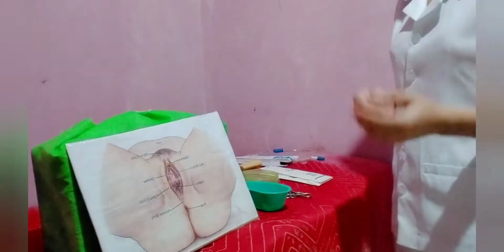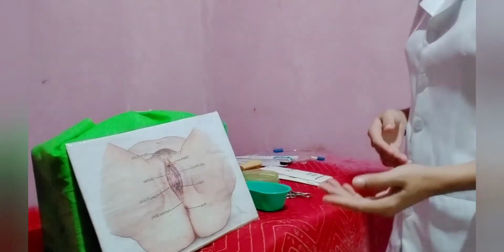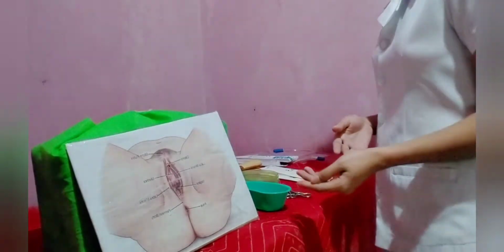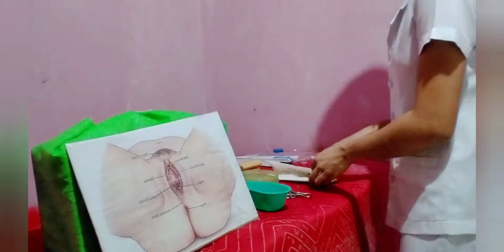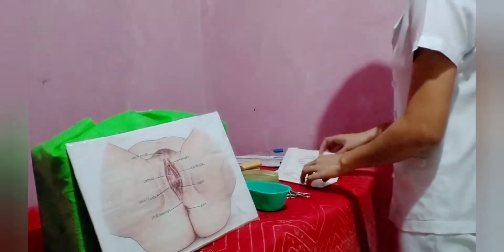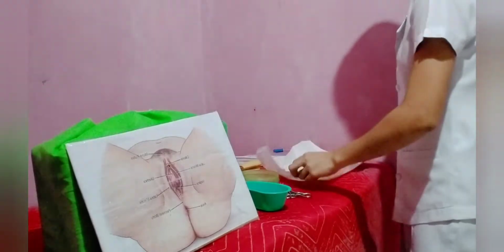And after cleansing the area, we have to open the set while observing sterile technique. This is to maintain its sterility. After that, we have to put on the sterile gloves. This is to prevent contamination and to maintain the sterility of the set. So, let's put on our gloves.